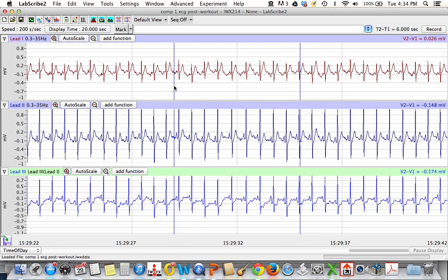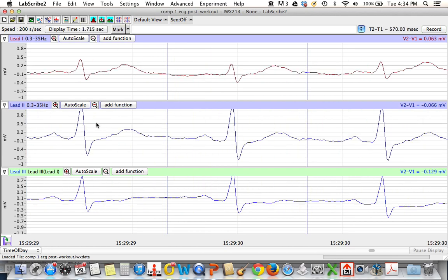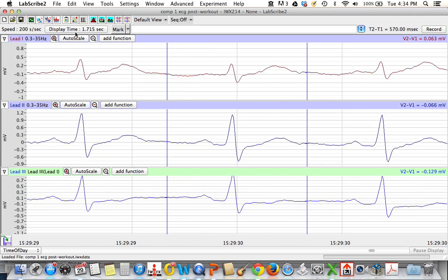And then what you want to be able to show is a couple of the different cycles here. And so we can set that up. I'll just zoom in a little bit here between a couple of these and zoom between 2 markers, and now we can see those waves pretty easily.